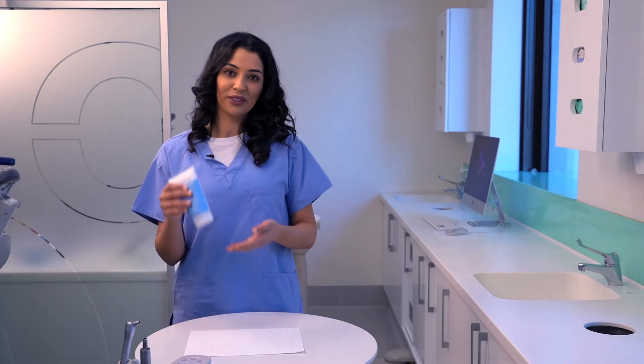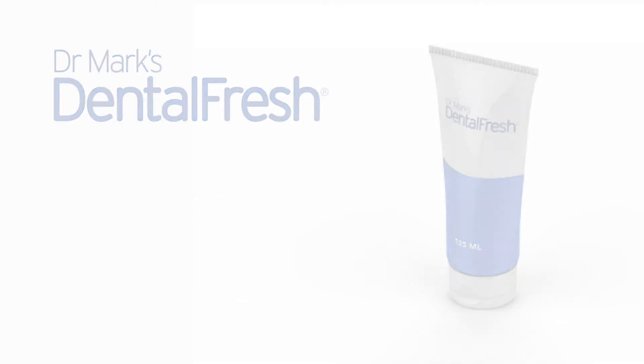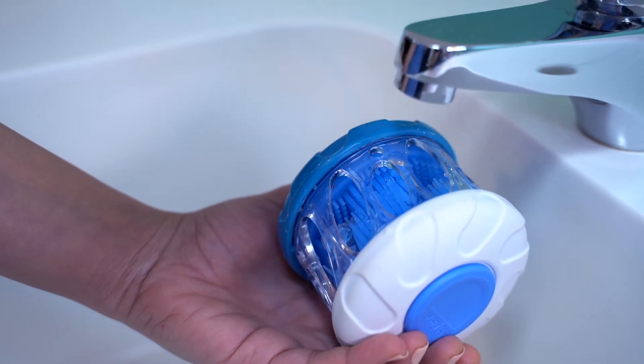Now let's apply Dental Fresh. Dental Fresh is custom formulated to clean all types of dental appliances. One to two generous drops and a splash of water is all you need.